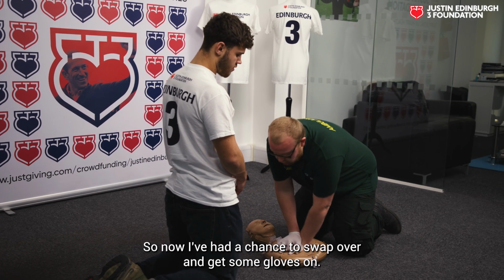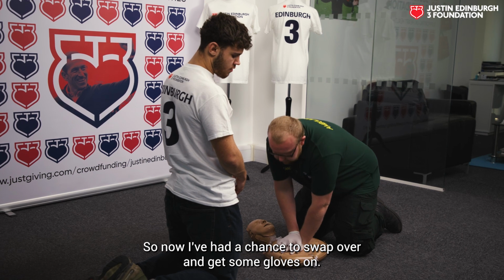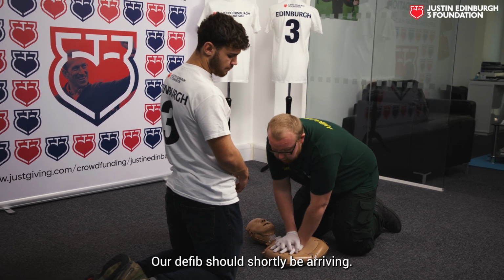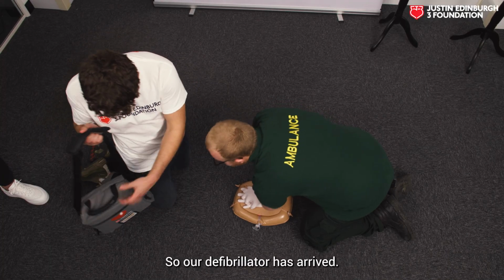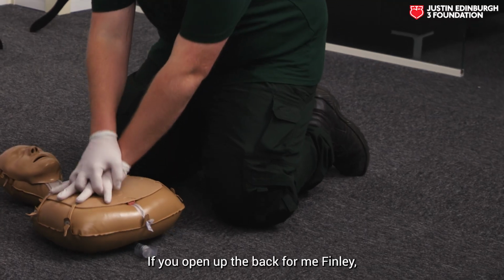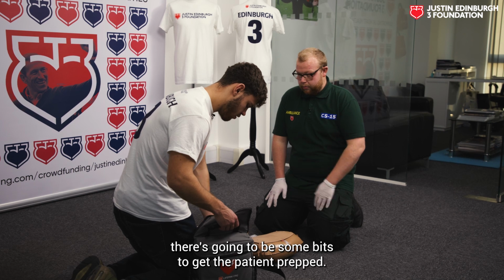Right, so now I've had a chance to swap over and get some gloves on. Our defib should shortly be arriving. Right, so our defibrillator has arrived. If you open up the back for me, Finley, there's going to be some bits to get the patient prepped.